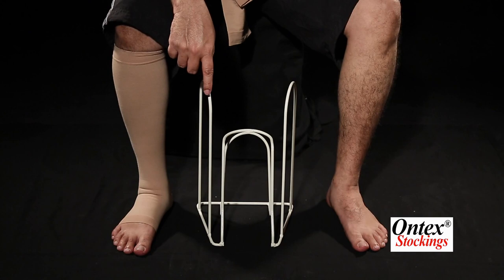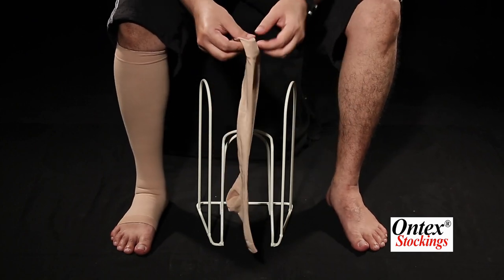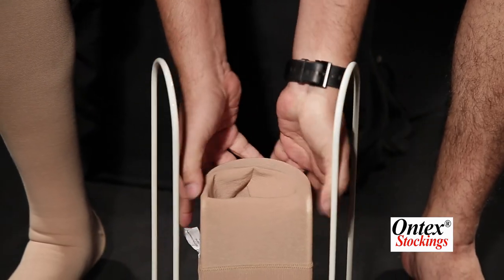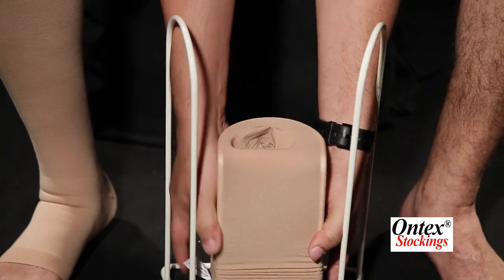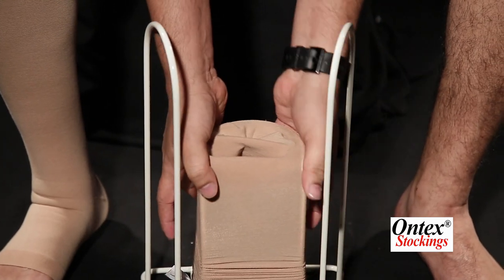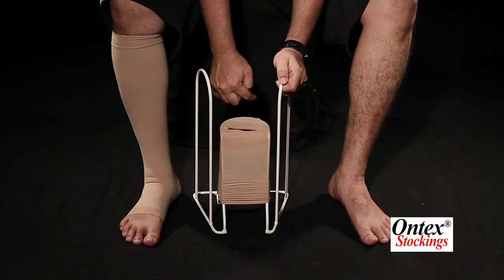You may also use this stocking application device — it is very easy to wear. Take the stocking and put it here, keep pushing down until you see the heel pocket. Now that you are able to see the heel pocket, ensure that it is facing towards you.